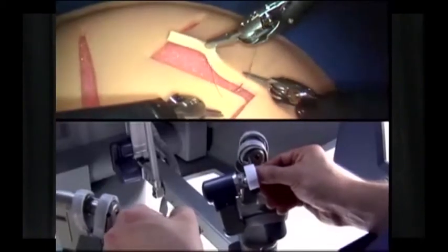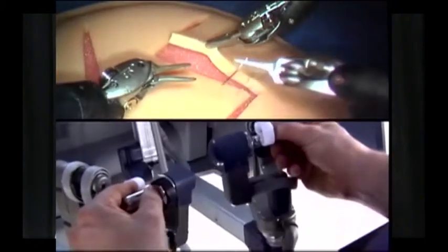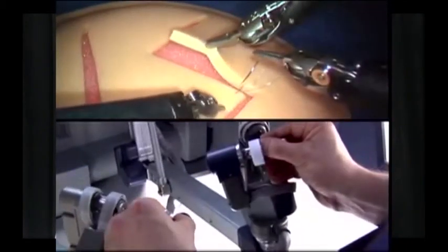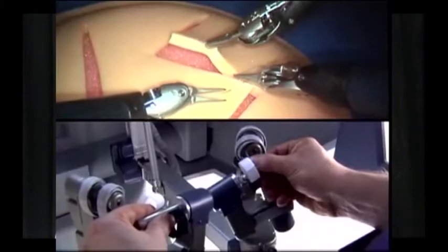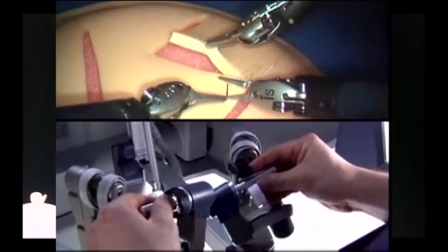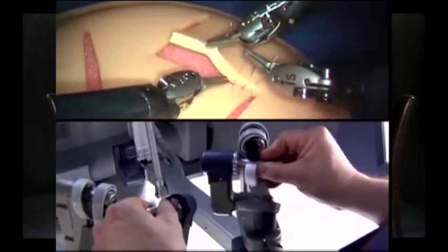Miriam, it's like this. The whole system is connected. The body of the robot stands next to the patient, and the cart on which the diathermy and the light source are kept is on the other side. There's a surgeon console, kept a little distance away from the table, and the surgeon is sitting behind the console. When he moves the fingers here, that is translated into the body of the robot, which moves the instruments robotically, mechanically. If you want the instrument to move 5 degrees, you can do that by manipulating the fingers. All that movement then translates to the inside of the patient.